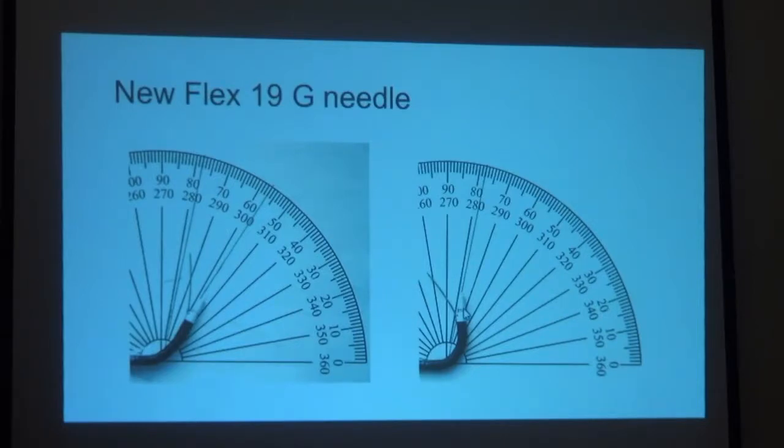So what you experience sometimes is that you do your ultrasound, you see the lymph node, everything's great. Now you put your needle in, and you want to try to reproduce the same image, and you can't. Now you can't have the scope all the way against the wall. So this ability to flex the scope with the needle inside to a bigger degree will give you a bigger advantage and make life much easier for you.